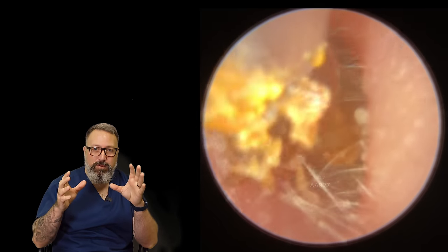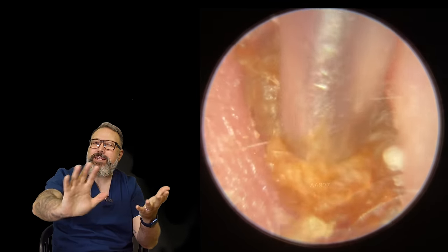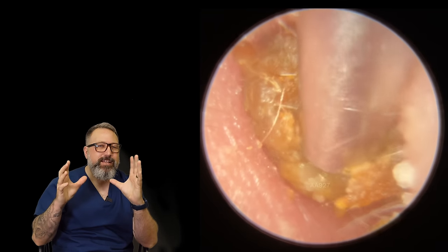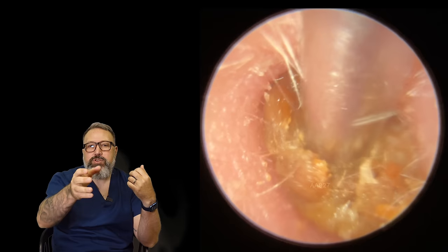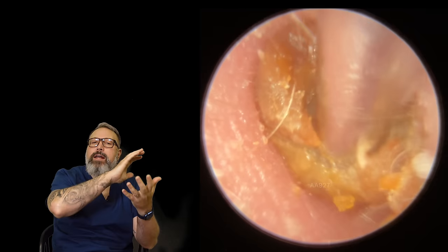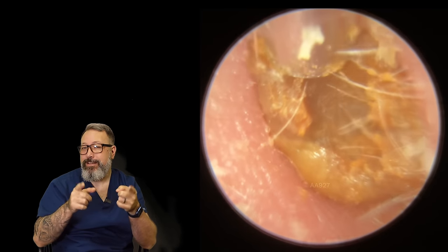He's getting this out now. We're almost there. Now see how the color changes? We had that real kind of shine, that sheen to that front section of wax, and now it's gone very matte. That's usually a good indication that the consistency has changed a little bit, in my experience anyway. So you can see we've got this almost putty type of ear wax now. We have this really hard surface layer, and then beyond that, this kind of softer putty layer of wax there. I avoided a foodstuff reference there, guys.